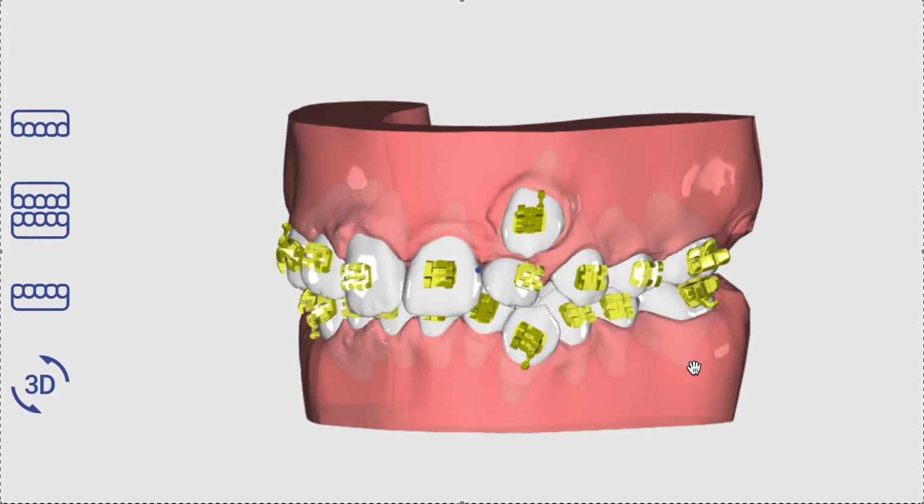But yeah, I would never do IDB with a company that doesn't show you the digital preview. I've seen some that do digital previews and they're still not putting them on right. So I don't know whether it's not being done digitally or someone's not doing the settings right. So it's really important to proof and preview.